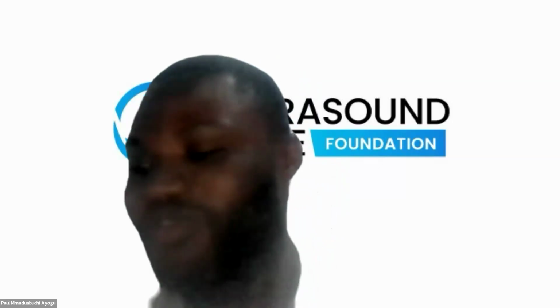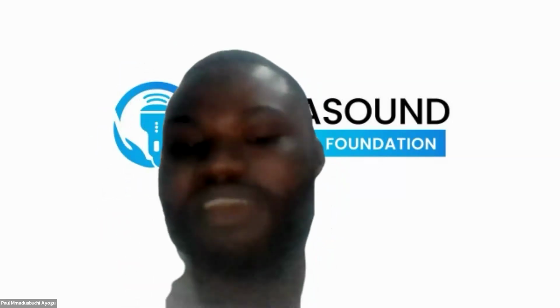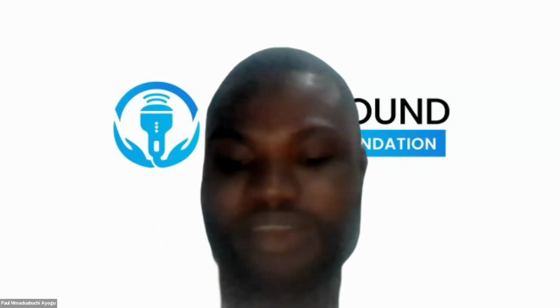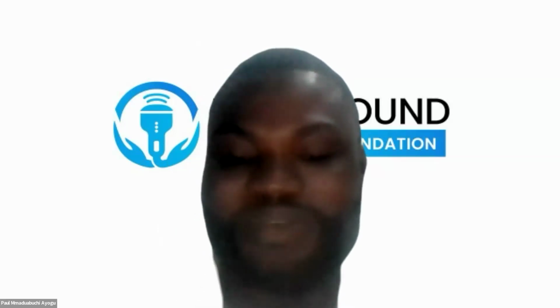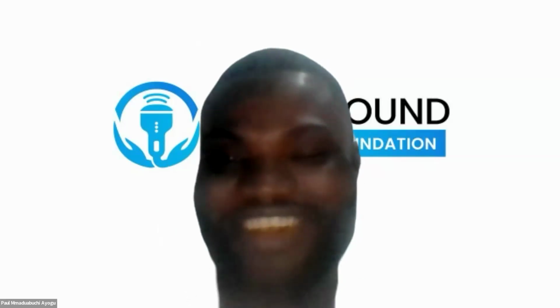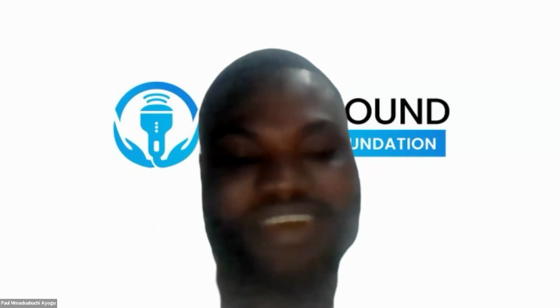So to the person that asked about it, if you bring out your AC, let me see if I can go back to that to explain further. Lashell also taught me something on that. Let me share this.